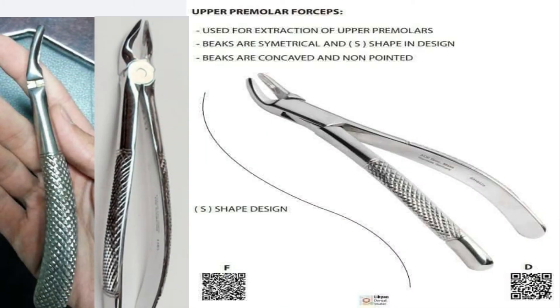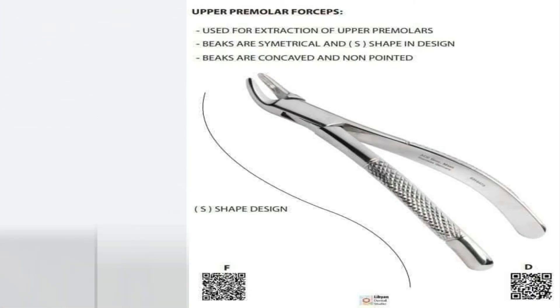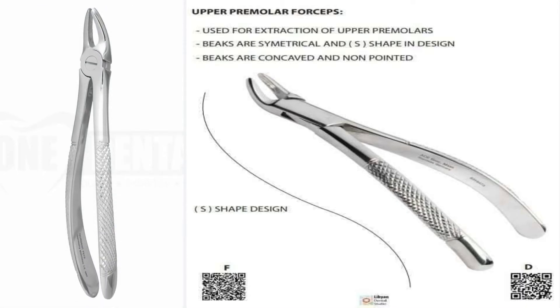Upper premolar forceps. It has two bends. The two blades are mirror images of each other and have no projections. It's used for extraction of both right and left upper premolars with the same forceps.